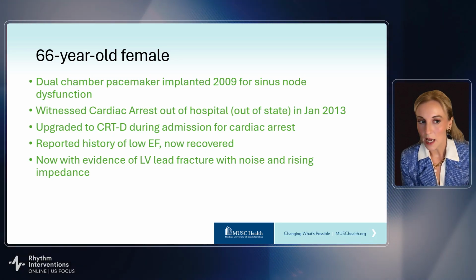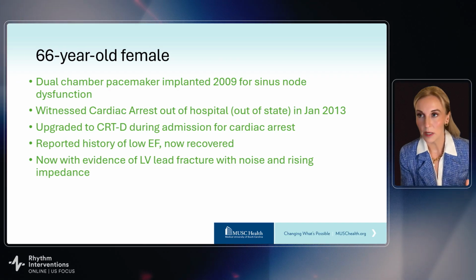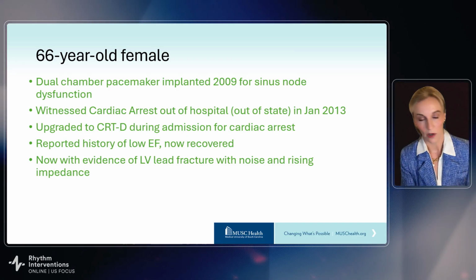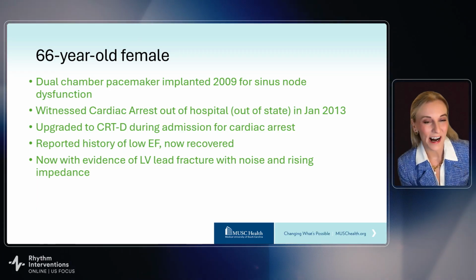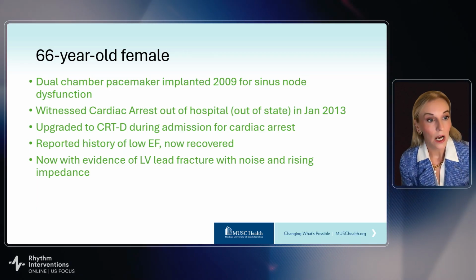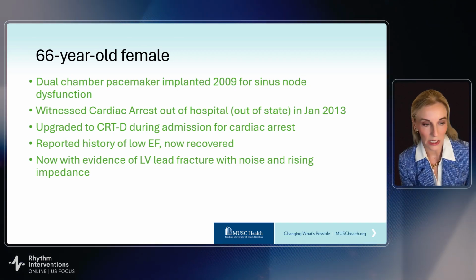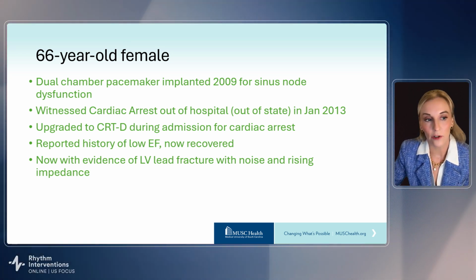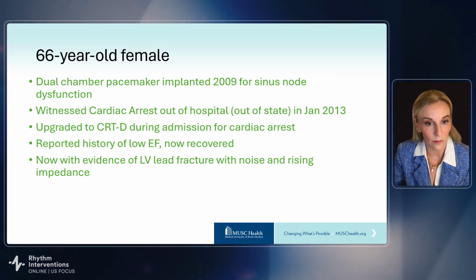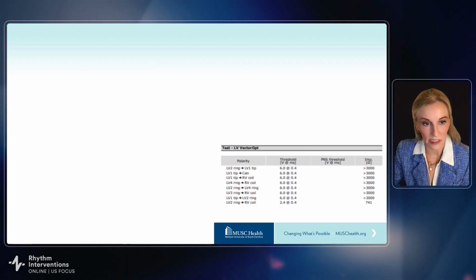Also during that admission, she reported, what she was telling me, she said, "Oh, well, they took one of the leads out of my heart." So great, good, as we would hope they would consider and think about. She reportedly had a history of low EF. Now it's recovered with good CRT. However, she's had some evidence of left ventricular lead fracture and noise with rising impedance. And so she has a Biotronik CRTD system.